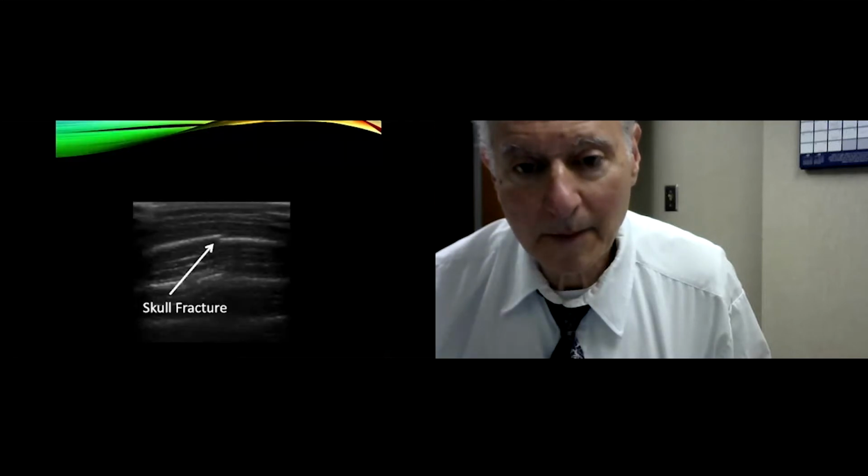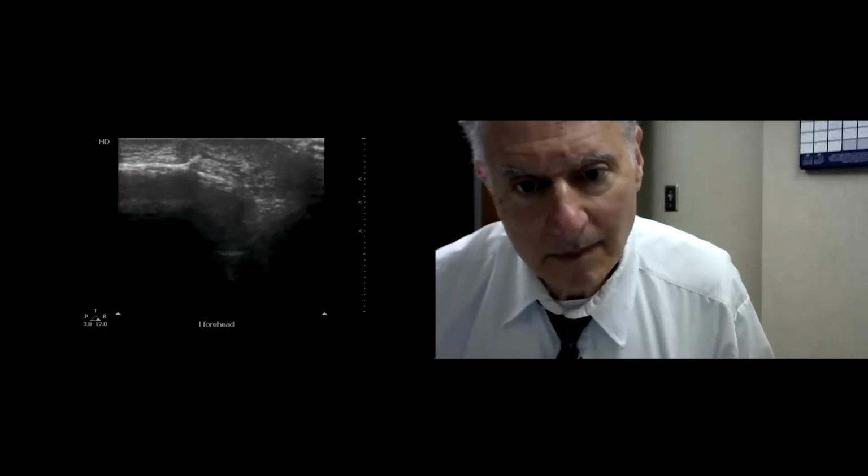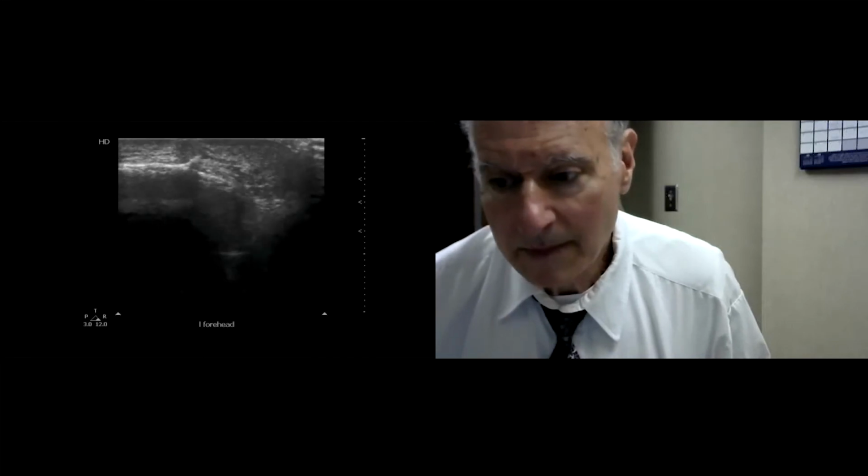And skull fractures, again, you have to make sure you're following that cortex, and you can see a nice little cortical disruption. Interestingly, I don't see that periosteal lift there, but nice cortical disruption. And this was actually a kid who came in, bonked his forehead, fell on a glass table, and he had a really sizable bump there.